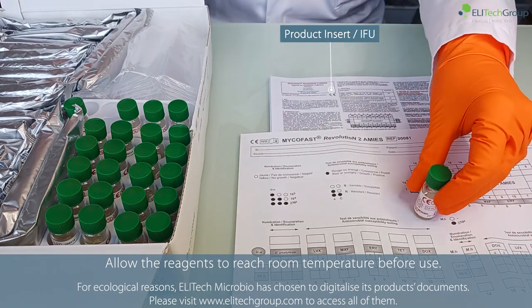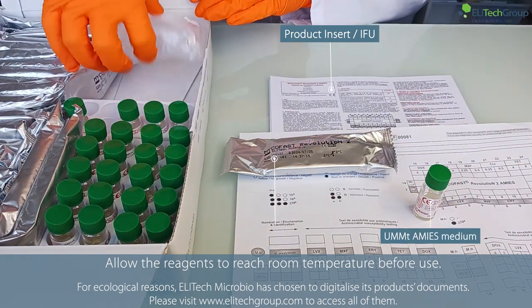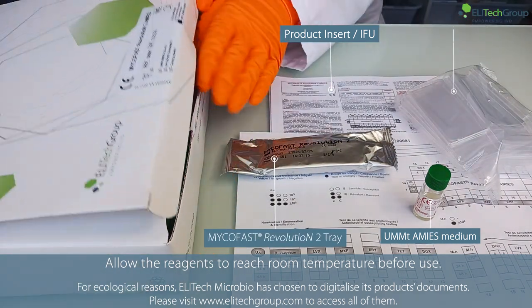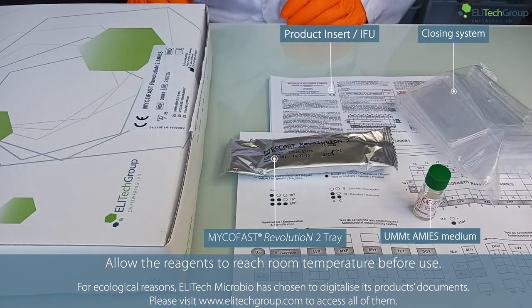Allow the reagents to reach room temperature before use. For ecological reasons, Elitech Microbio has chosen to digitalize its product documents. Please visit www.elitechgroup.com to access all of them.